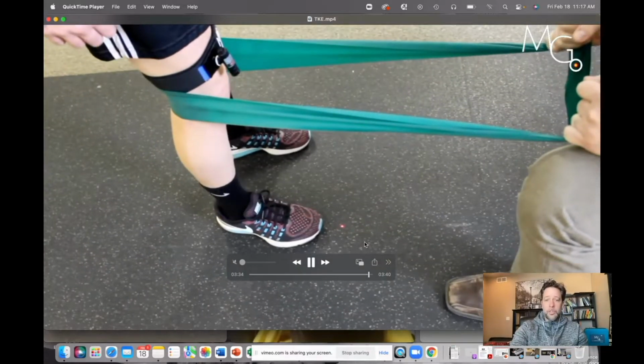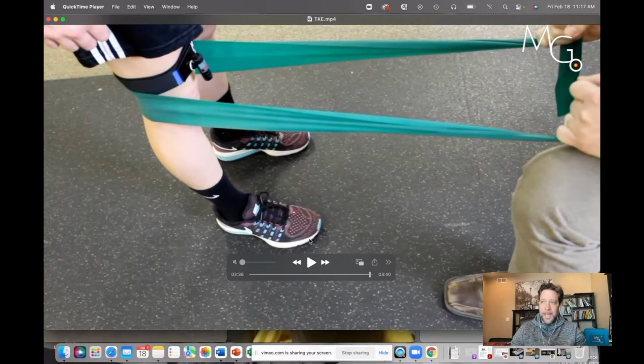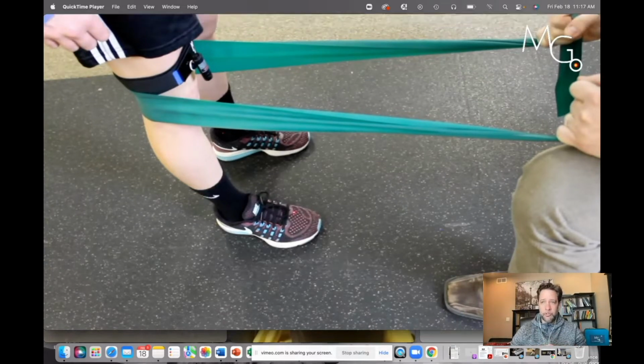So now that you've worked on that with your patient, if they can't get it and sustain that improvement, or they're really struggling, I automatically send them home with a patient pack. They have to be able to do this for repetitions. Most patients, in my experience, can learn this. There are some who can't. And whether it's effusion and swelling, whether it's pain levels, maybe there's some psychological overlay with that.